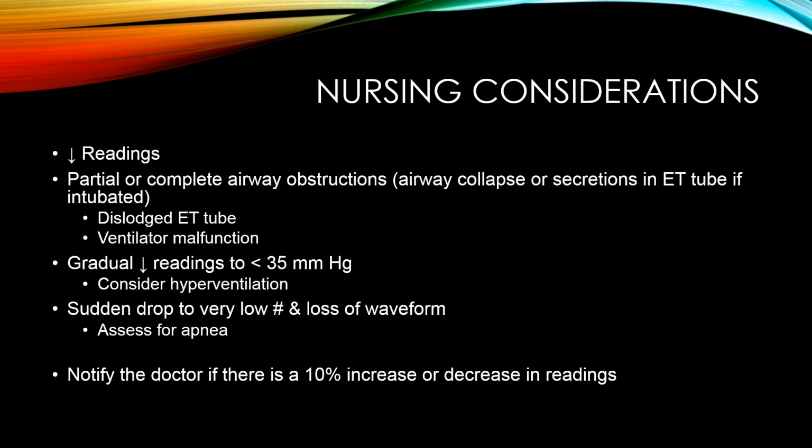If you notice that there is a 10% increase or decrease in your readings when you are trending this, let the doctor know, just because there may be something going on that they need to intervene with. So just kind of a rule of thumb, a 10% increase or decrease is when you want to let your physicians know.